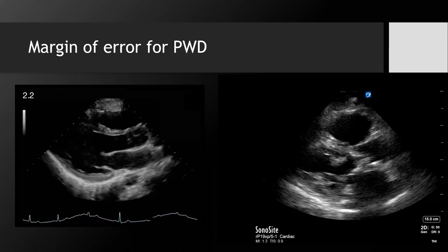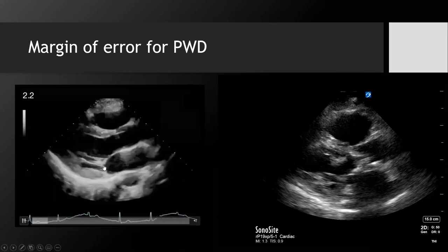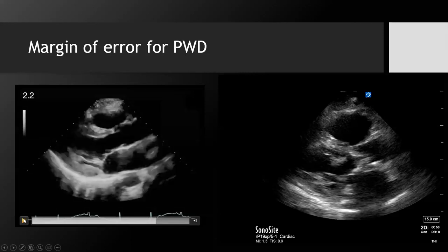Any other thoughts or questions? I have one other point to share on this last slide, which is not proven, just my understanding of things. You might notice that in this patient, their LVOT, whether here, here, or here, is healthy, and their valves are opening. This distance is probably just about the same.